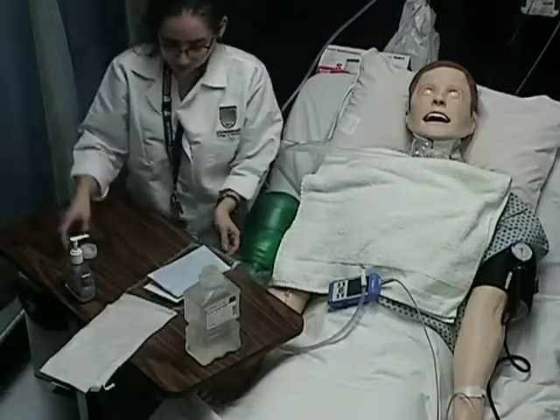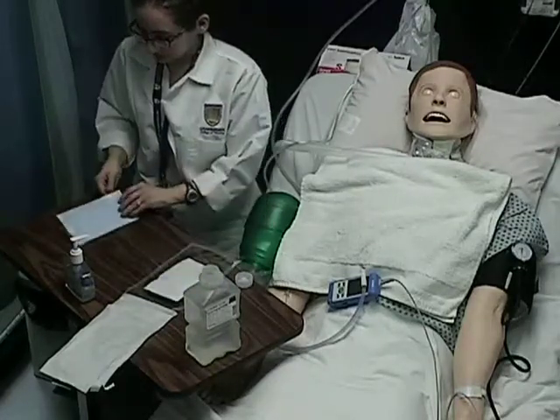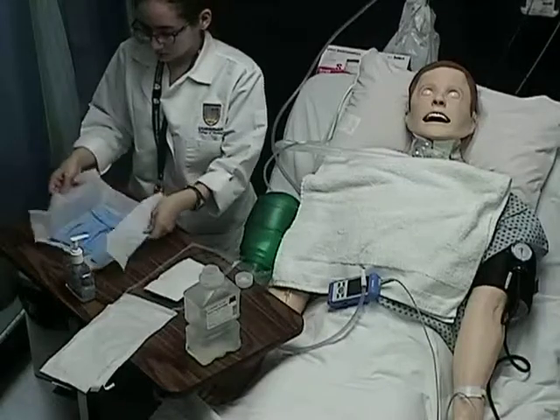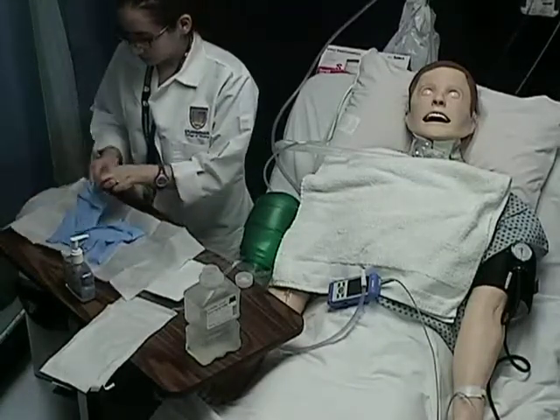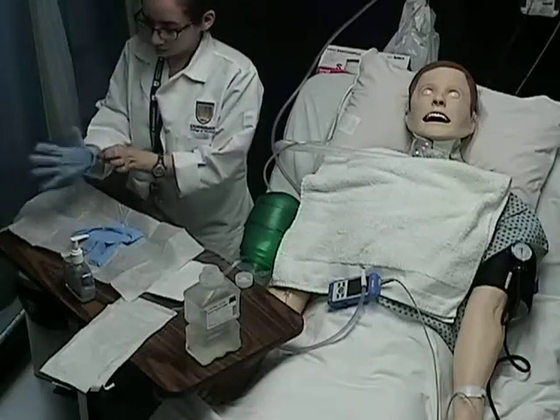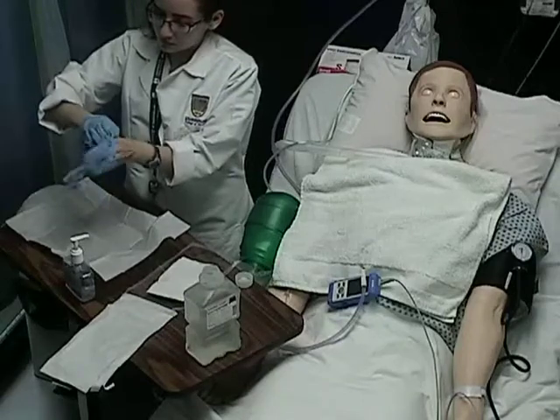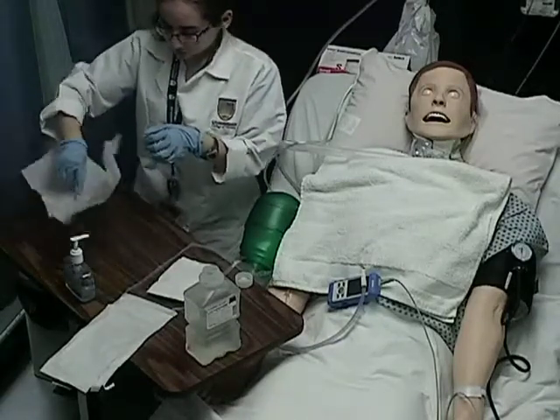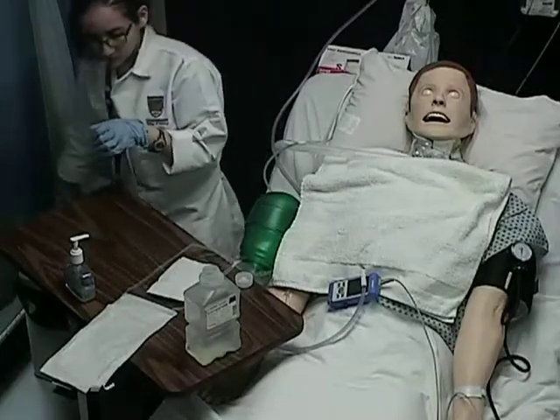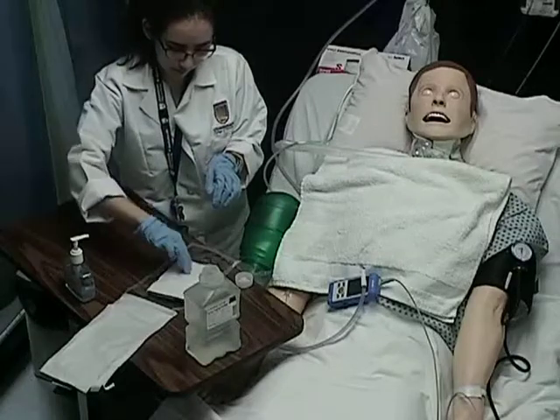Apply the sterile gloves. Remove the box from the kit and place on table.